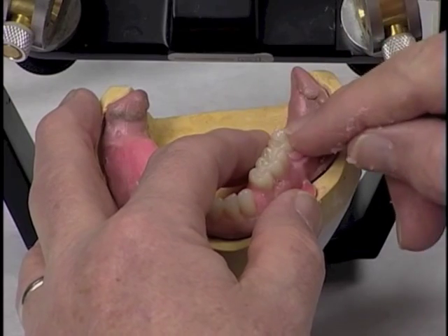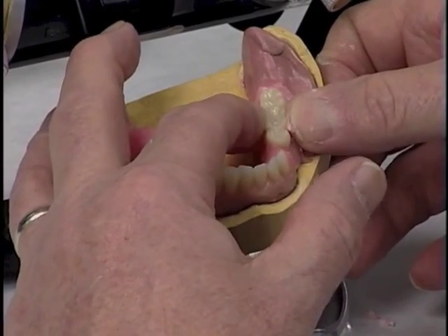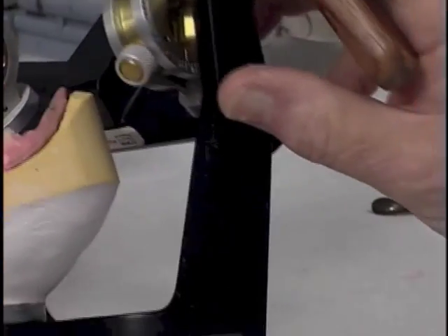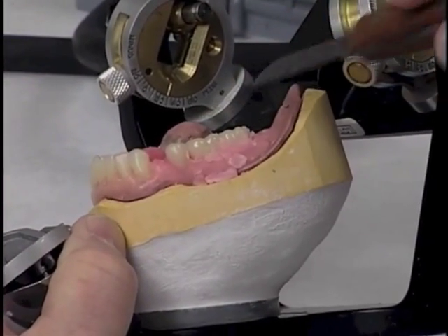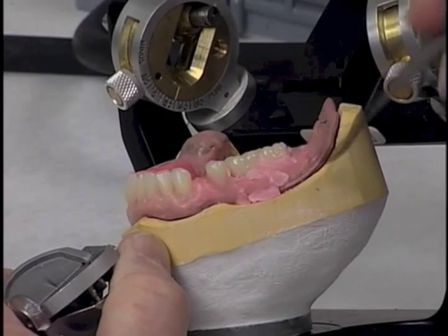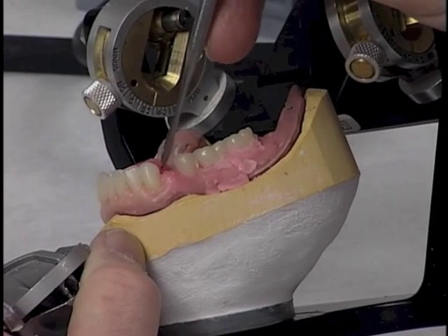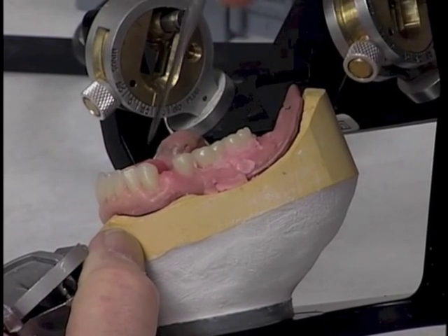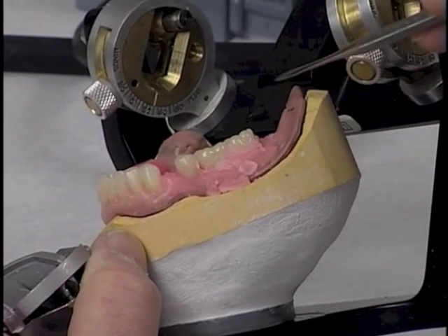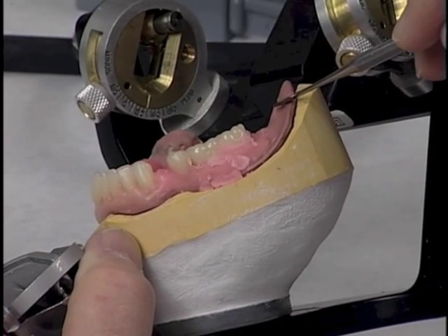And we can see when we look at this, we're beginning to form now a curvature that is both buccolingually this way, but we're beginning to form a curvature this way, in that these cusps should be a little higher than these cusps. I think that we need to raise that second molar on the distal just a little. And when we have the tooth filled in here in the space that we have created here, we should have a nice curvature starting from the tip of the canine through all of these teeth and curving up, with the plane ending up about 2/3 up the retromolar pad.